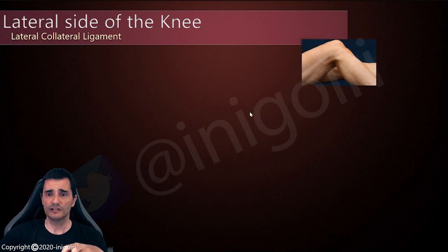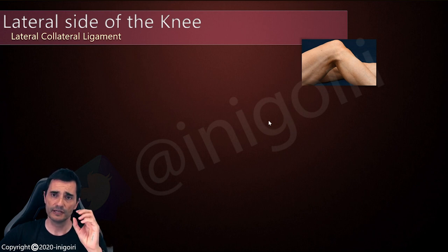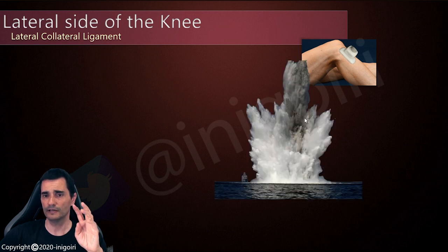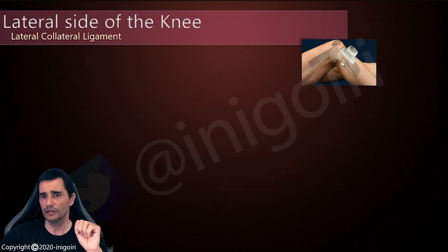What about the lateral collateral ligament? When I started searching this ligament, it was difficult because it's a very thin ligament. It has a cylinder shape, but it's very thin. It's not like the medial collateral ligament, which is very wide, so it's difficult to find. Like in the battleship war game, we miss the lateral collateral ligament in this area, because the distal insertion in the fibula is very posterior.